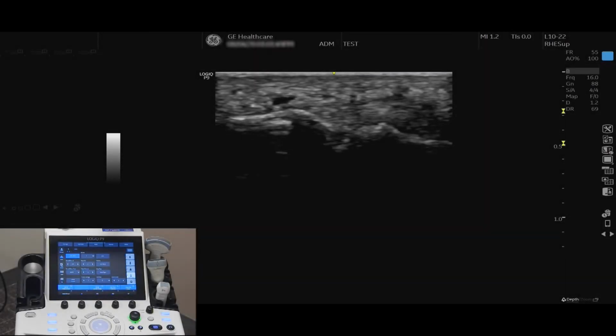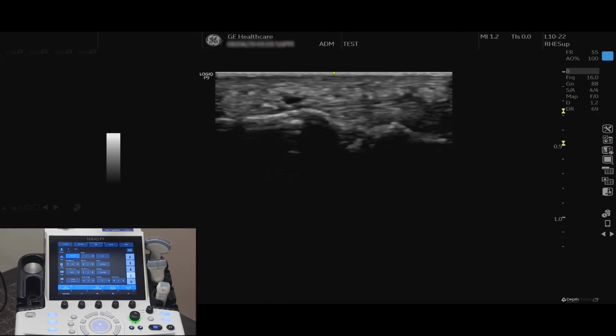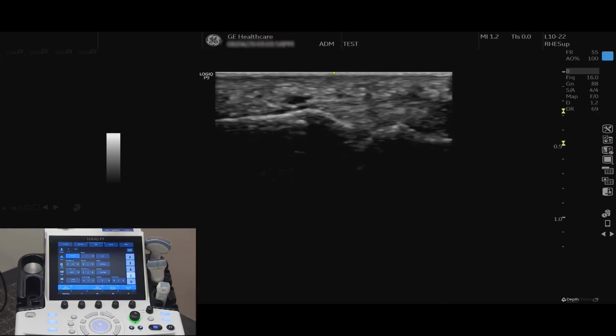Color quantification is a feature that allows you to quantify blood flow. It is available in Cine mode. Scan the anatomy of interest and activate color or power Doppler imaging.